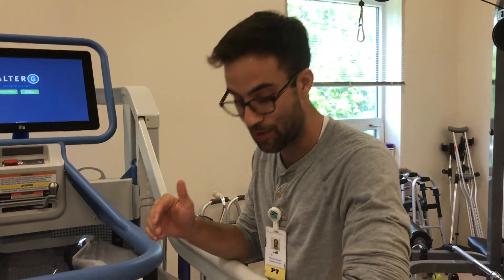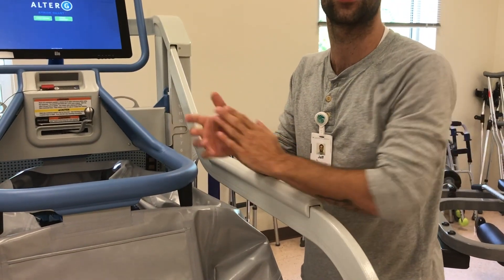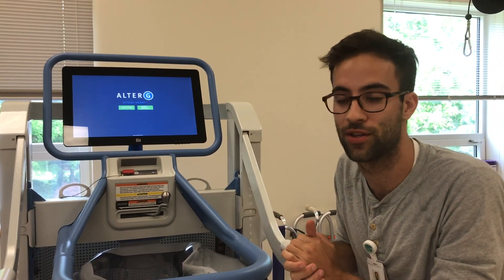A lot of people fear treadmills because they see the belt just going and going and feel like they won't be able to walk fast enough. It turns out we don't even have to turn the treadmill belt on. You can just do static balance activities, reaching activities, and dynamic activities without the belt on.